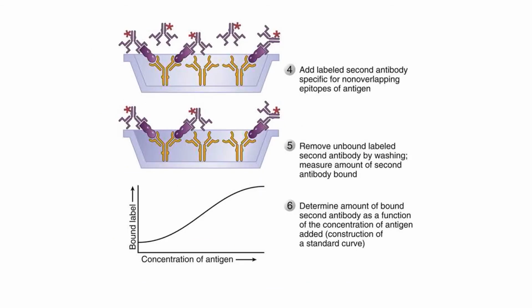So you've got your primary antibody, then you attach your target antigen, and now you put your second slice of bread to complete your sandwich, meaning you pipette in your secondary antibody. And then you incubate it to let the antibody bind to your antigen. And then you wash it again. You pour in your buffer solution, you turn your plate upside down, and then you bang it on your lab bench. Hard. I mean, don't be shy about this.